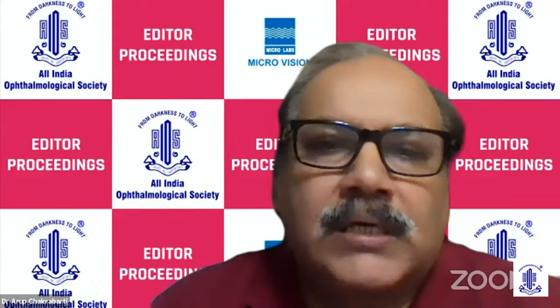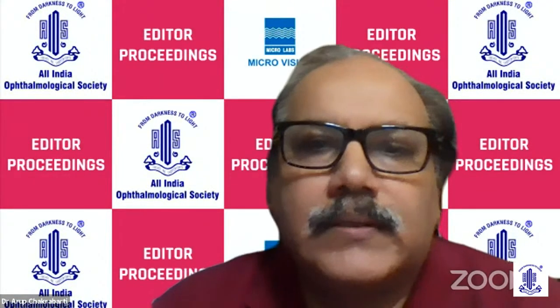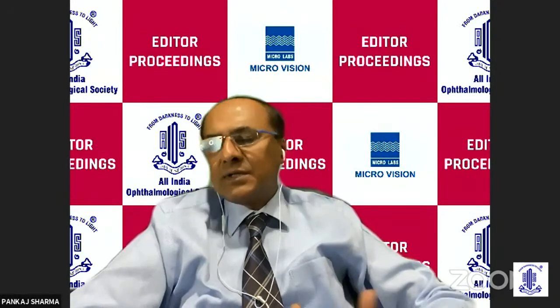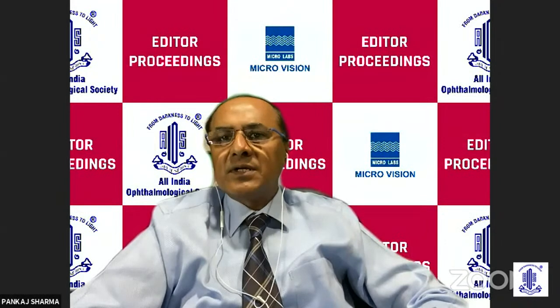What about Dr. Pankaj and Dr. Sriganesh? I was just wondering, if the tear film is not that stable, can we do the keratometry with the Scheimpflug imaging? Because that usually bypasses the tear film, and it just takes photographs, and it gives much more accurate results, I feel. What would you say, Doctor?